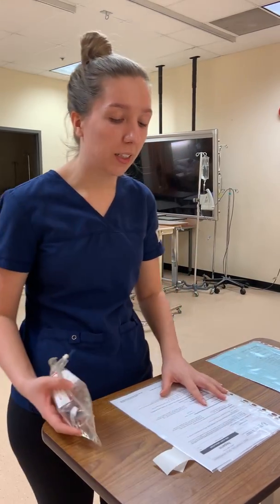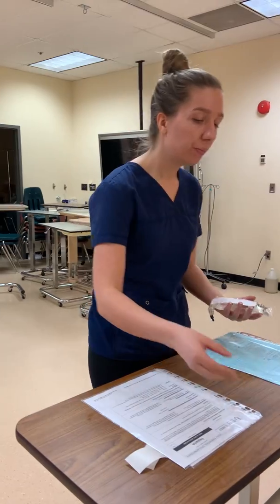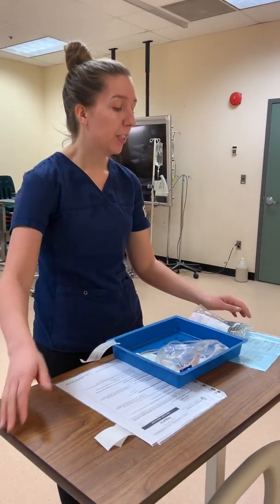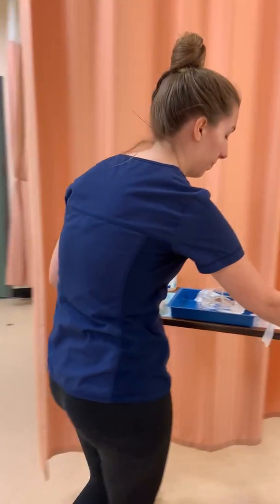At this point, I can gather the appropriate equipment and go to my patient's bedside since my second nurse has confirmed that I have all the correct checks and equipment. Now I can go into my patient's room after receiving that check by my second nurse. So I have my medication, I have the appropriate tubing I need with no ports, I have alcohol swabs, and I also have a label for the tubing. So I'm now going to walk into my patient's room.